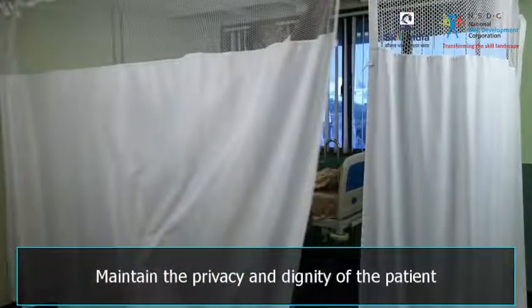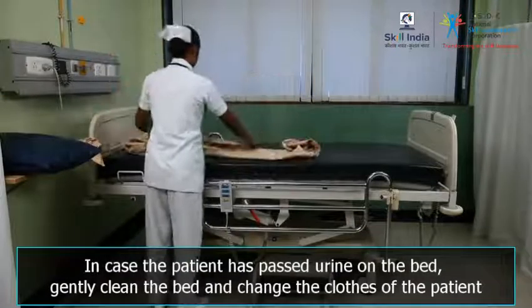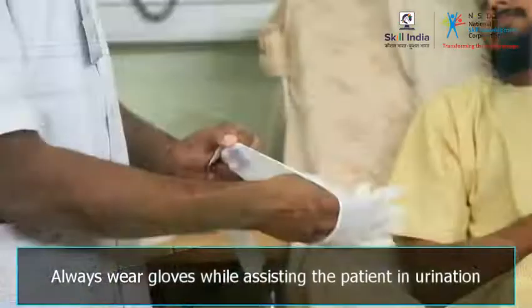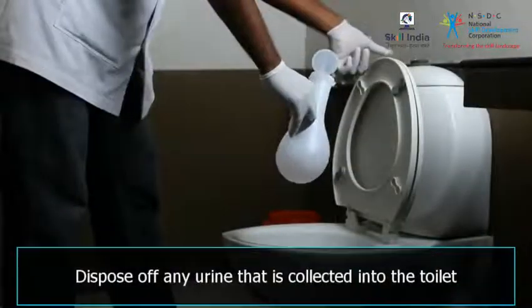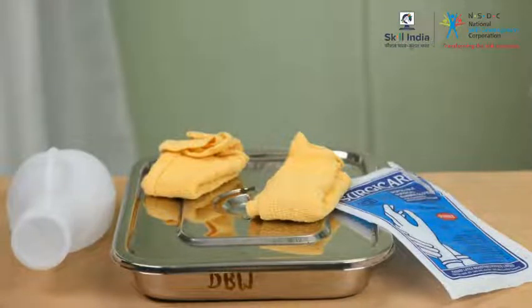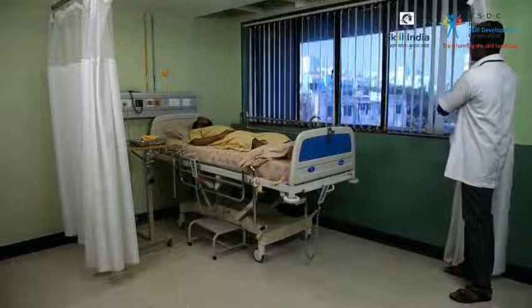Maintain the privacy and dignity of the patient. Explain the process of urination with the help of equipment and cover the patient appropriately while they are urinating. If the patient has passed urine on the bed, gently clean the bed and change the patient's clothes, ensuring that the patient is not embarrassed. Always wear gloves while assisting the patient in urination or while collecting urine to measure output. Dispose of any collected urine into the toilet and ensure all equipment is thoroughly cleaned and sanitized. In many cases urine accumulation can lead to bad smell — open the windows and ensure that the air is cleared from time to time.